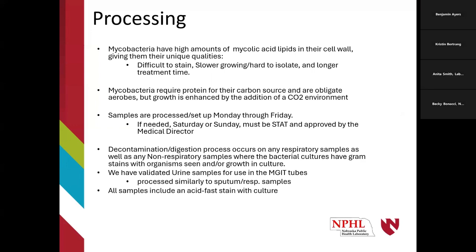Mycobacteria also require proteins for their carbon sources. They're obligate aerobes, meaning they need to grow in the presence of oxygen, but they are enhanced by the addition of a CO2 environment. Again, we process samples and set up Monday through Friday. If needed on Saturday or Sunday, it must be stat, and it has to be approved by our medical director or associate director.